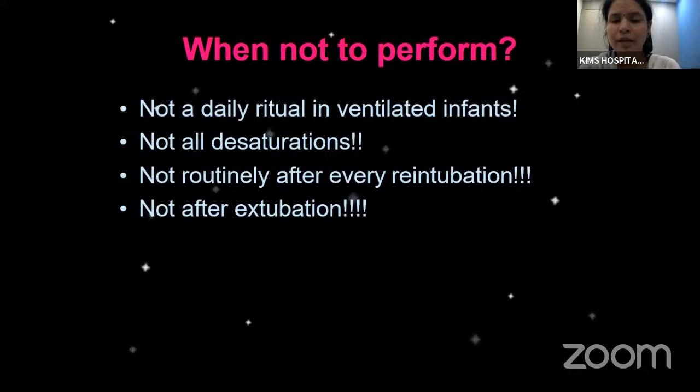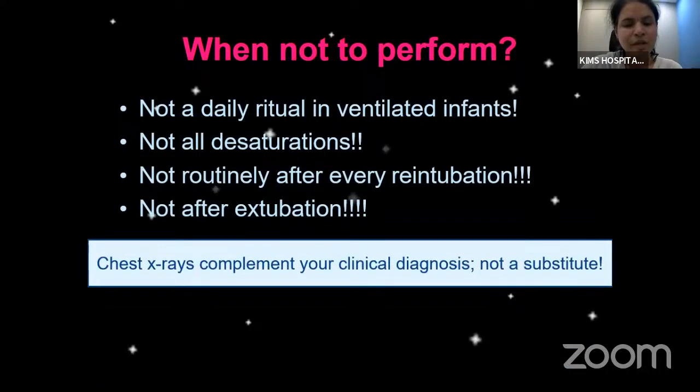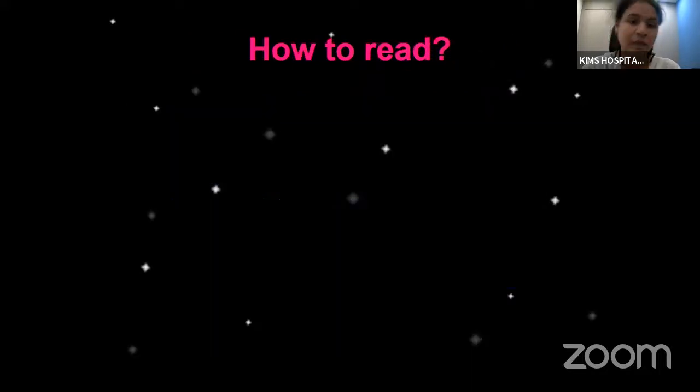Likewise, X-ray is also routinely not indicated after every reintubation, as we already discussed. And if after extubation, the newborn seems to be doing fine and is clinically improving, and we don't see any worsening distress that may potentially lead to increase in the respiratory support, an X-ray is again not indicated. So there is also no role for regular routine repeat X-rays after giving therapy such as surfactant replacement therapy. So these are all some indications, or rather contraindications, for performing an X-ray, which are often relevant to most of us in our clinical practice. So chest X-rays importantly complement our clinical diagnosis and are not to be used as a substitute for clinical diagnosis.